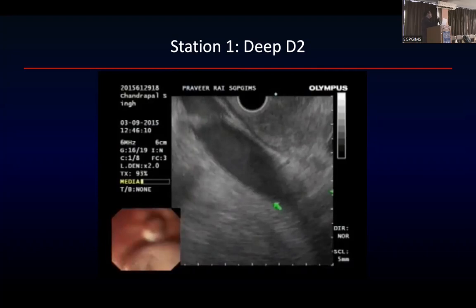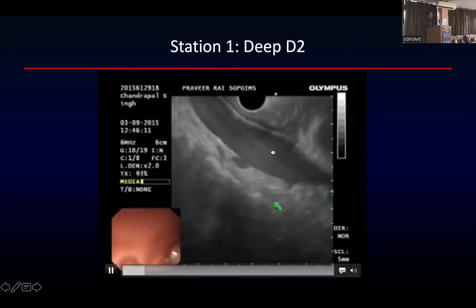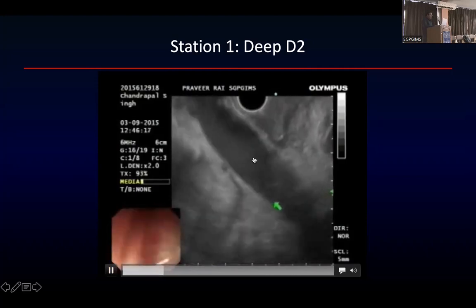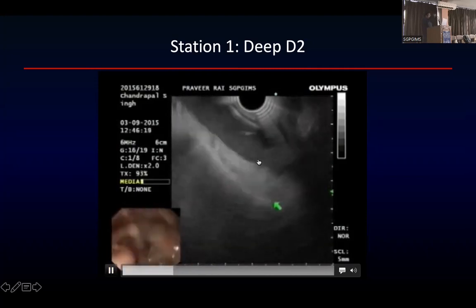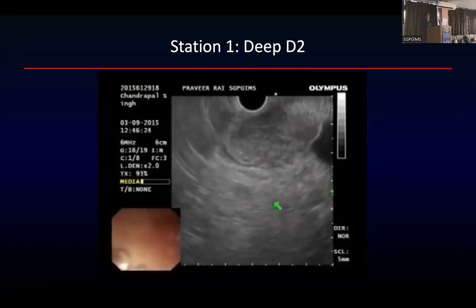क्यों? क्योंकि unstable होता है, वो दिखता नहीं, कई बार aorta नजर नहीं आएगी आपको, aorta नजर नहीं आएगी तो मुझे, I'm not sure whether you can really comment the uncinate part here. It can well be head of the pancreas. Okay, so once you see this, ये IVC है, you can see IVC, ये aorta. अब मैंने aorta को पिक्चर में रखा, क्या मूवमेंट हो रही है? जस्ट क्लॉकवाइज एंटी क्लॉकवाइज मूवमेंट एंड पुल बैक. This is what you are doing.